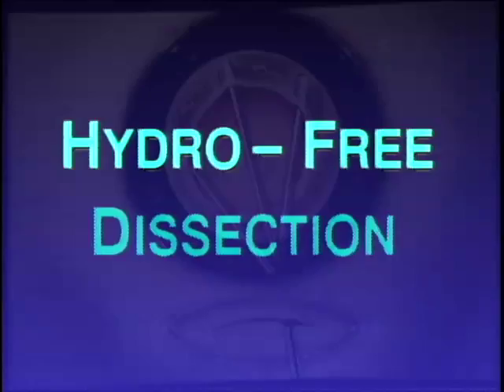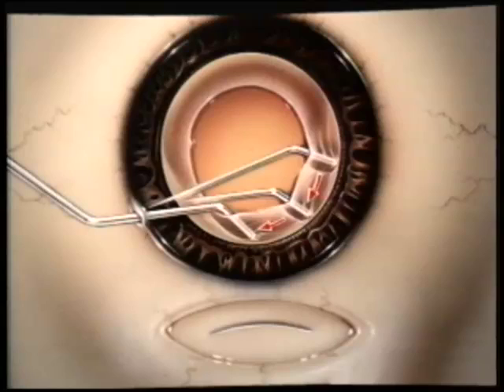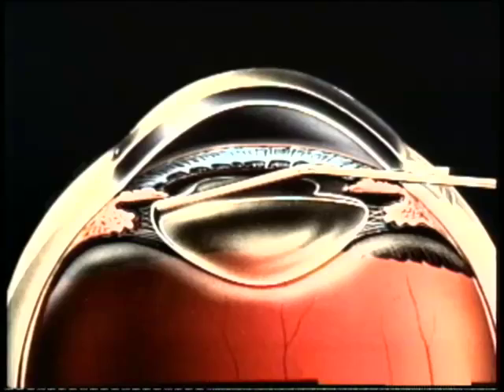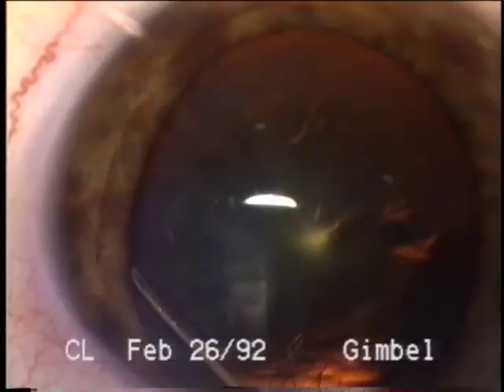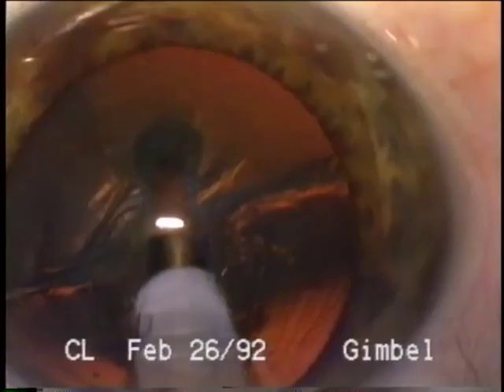Following capsulorexis, hydro-free dissection is accomplished using the cannula to lift and tent the anterior capsule in a sweeping motion to separate it from the cortex back to the equator of the lens. This manual separation of the capsule from the cortex, or hydro-free dissection, is achieved with a straight cannula to reach the inferior portion of the anterior capsule and a straight or bent cannula through the paracentesis to reach the 12 o'clock area. No fluid is injected at this point. With this separation of the cortex anteriorly, there is less resistance to rotation of the lens within the capsular bag.